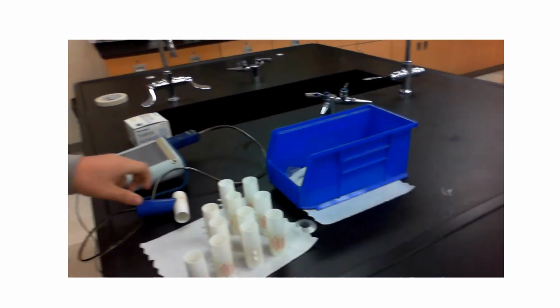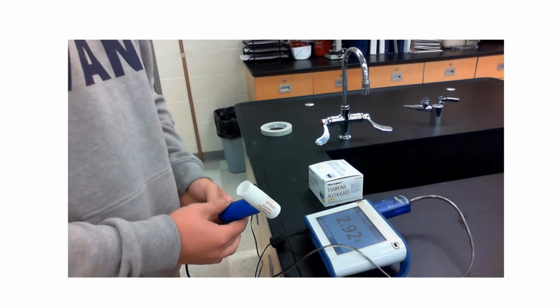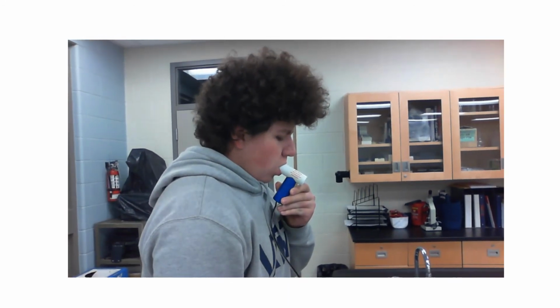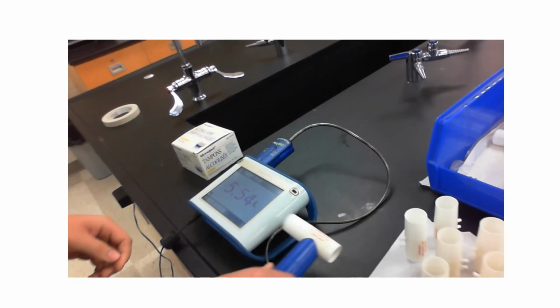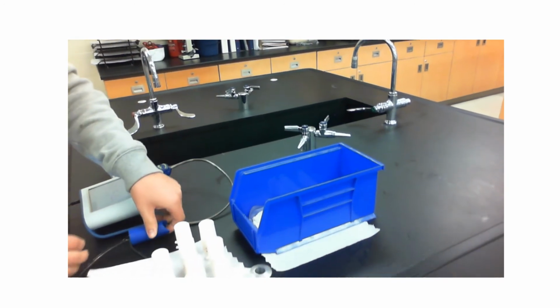All right, this is the easier one to do because it's your vital capacity. It's the biggest breath you can take. So the process is the same. You press the triangle in the bottom left corner, wait till the thing turns ready. Biggest breath in. And again, stop it. Perfect. And then we record your vital capacity. Take your mouthpiece off, put it into the blue bin. That's where the dirty ones go.